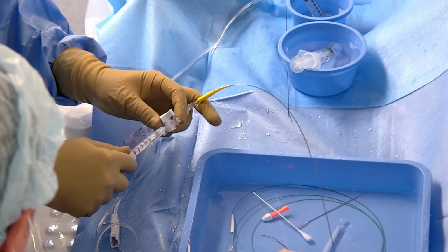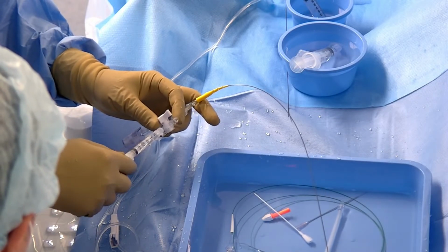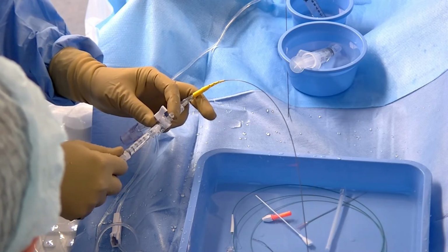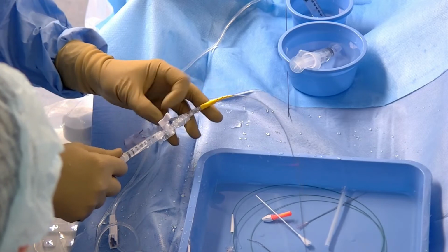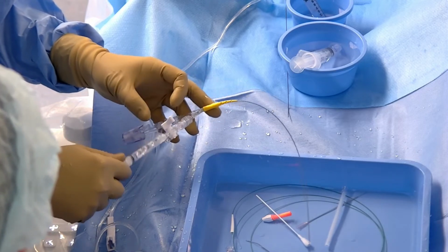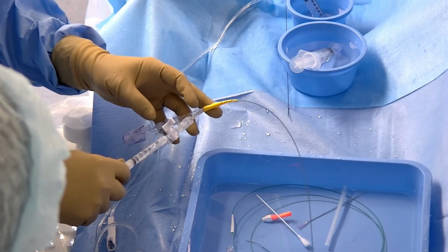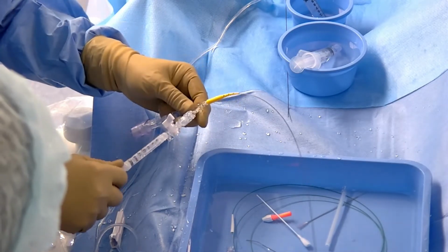Yalota, what kind of balloons are you using in Ulaanbaatar? Eclipse, HyperForm and Scepter, yeah? Hyperglide. Do you have Scepter in Ulaanbaatar? Yes? No Scepter? No, okay.